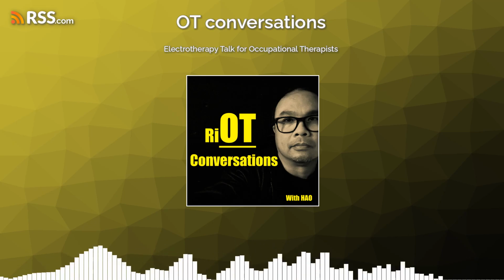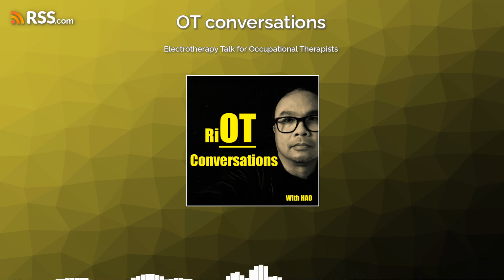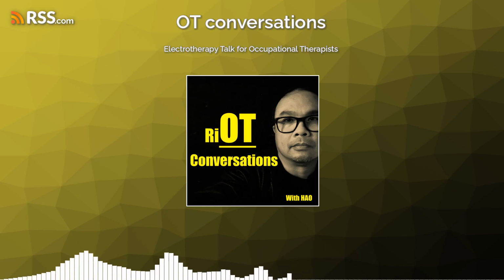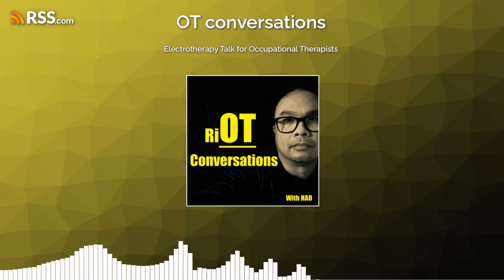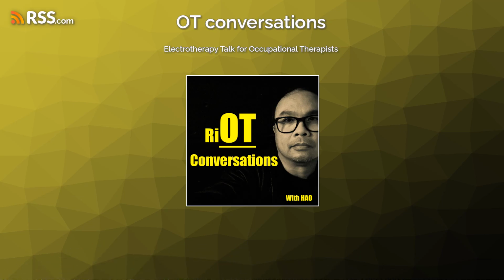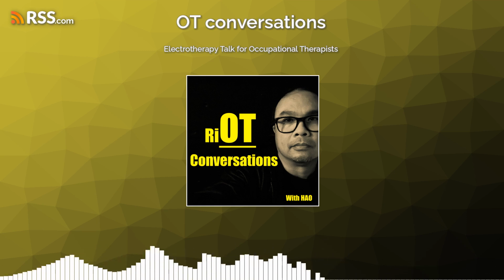Interferential then becomes a varying frequency. It can be a short pulse frequency, and if you listen to the sound, the analogy is it will go pub, pub, pub, pub, pub. That's the varying degree. Whereas the NMES would just be pub, so consistent frequency.